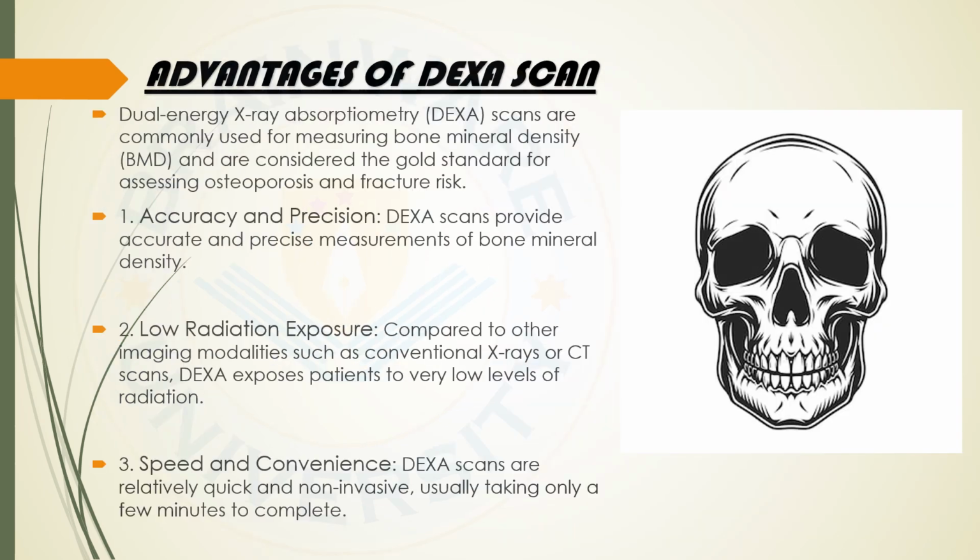So, what are the advantages of the DEXA scan? If we compare it to other scan modalities, what does it give better than the other scans? Dual energy X-ray absorptiometry, that is DEXA, is commonly used for measuring bone mineral density and is considered the gold standard for assessing osteoporosis and fracture risk.